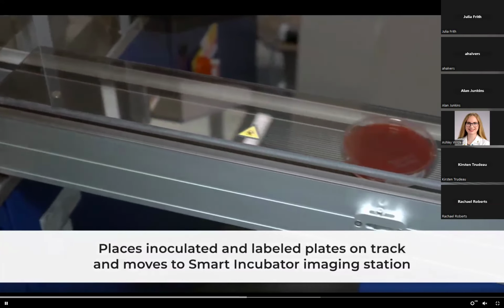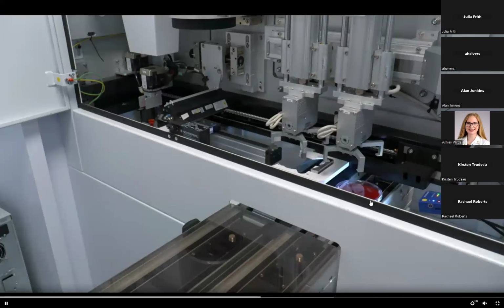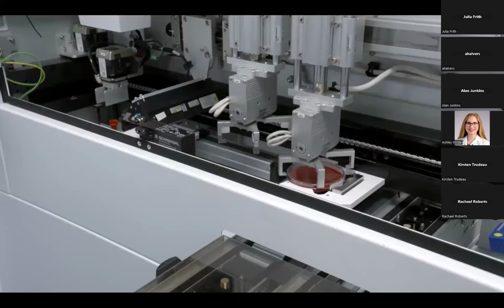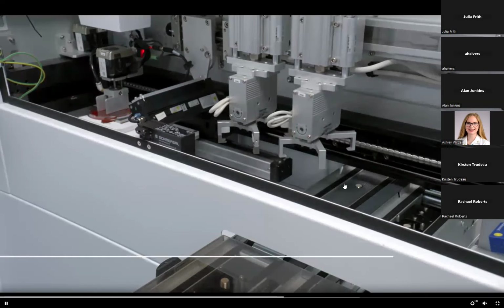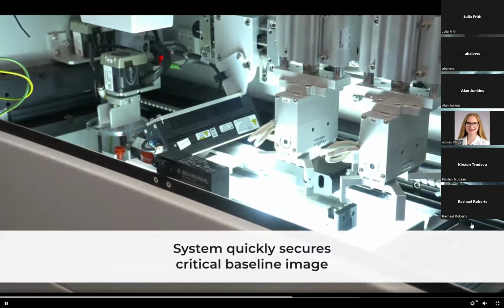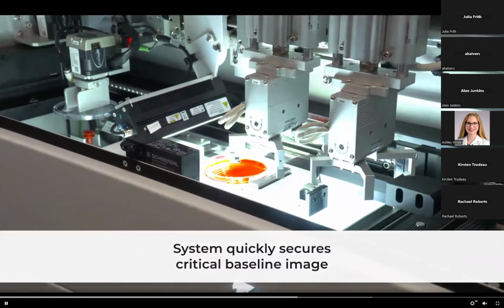Now, this is going to show you what's actually inside the instrument. We don't leave the instrument open like this, but it's going to bring the plate in here. Again, it scans it to make sure it knows which one it's got. It's going to set it right there. Then it will photograph it, give a time zero picture. Here it comes. That way, you know if there was something wrong with the plate to begin with.